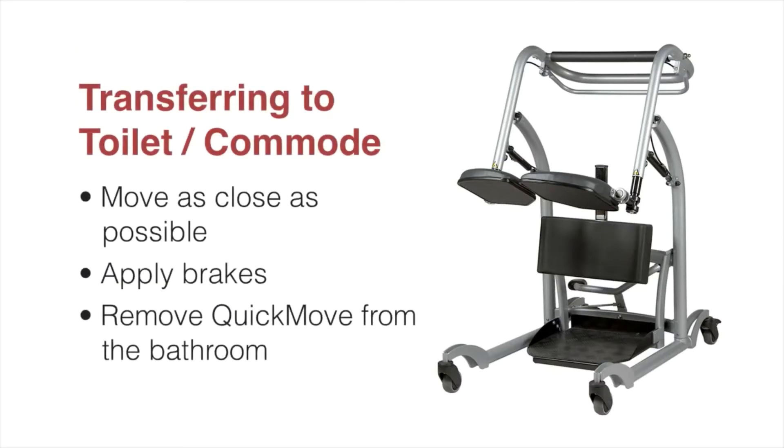When helping a patient to the toilet or commode, move as close as possible and then apply the brakes. The patient can undress themselves or you may assist them as needed. Some patients may require that you stay with them; if suitable, let the patient have some privacy. For safety, remove the Quick Move and leave the bathroom.